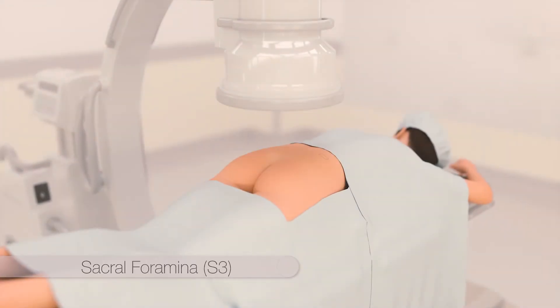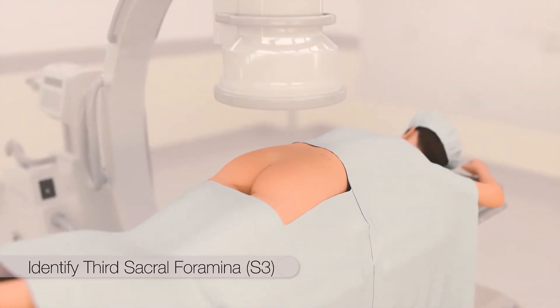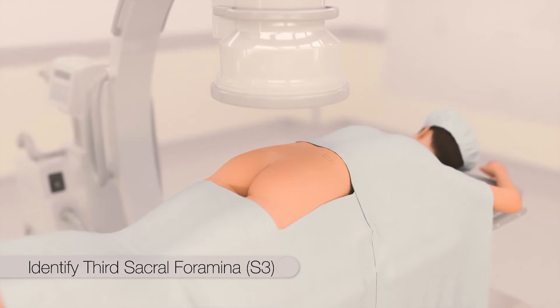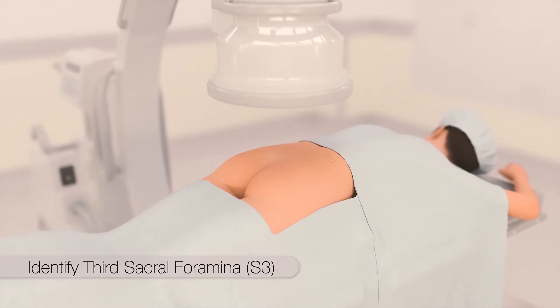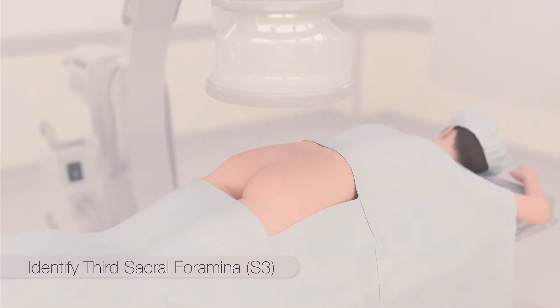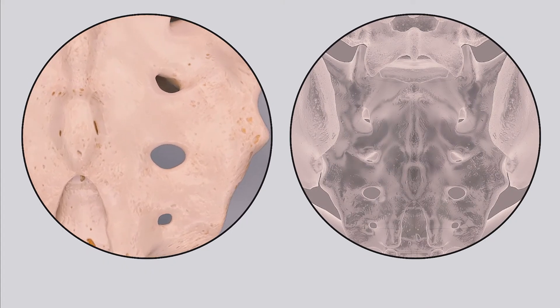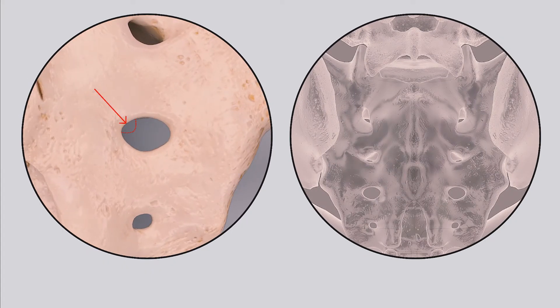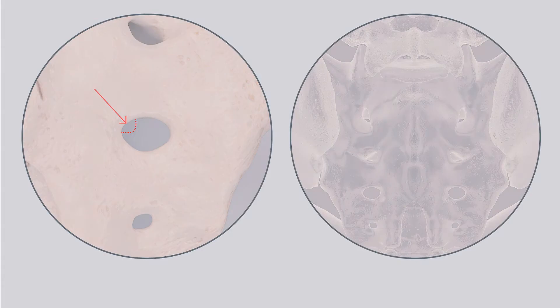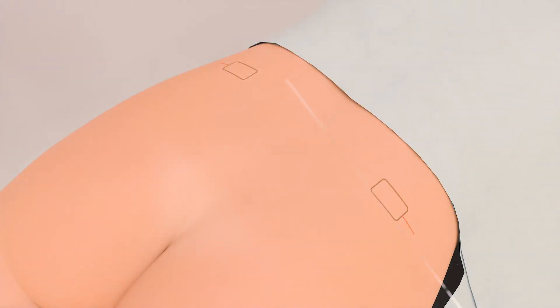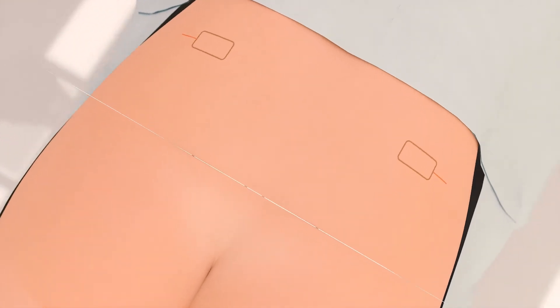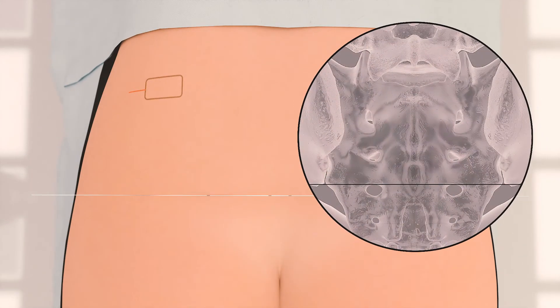Once the patient has been prepped and draped, AP fluoroscopy is used to identify the level of the third sacral foramina S3. The ideal location for lead placement is in the uppermost medial portion of S3. The directional guide is placed at the inferior aspect of the sacroiliac joint. This landmark identifies the level of S3.